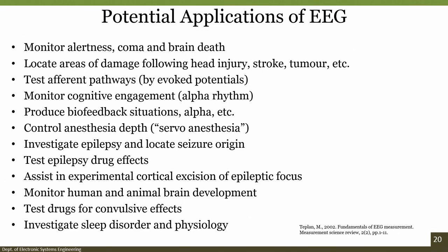It can be used for investigating epilepsy and locating seizures. It can be used to understand the efficacy of drugs, which are anti-epileptic drugs. It can be used in assisting in experimental cortical excision of the epileptic focus. It can be used for monitoring human and animal brain activities and development. It can also be used for testing drugs for convulsive effects and investigating sleep disorders, as well as physiology. So the applications of EEG, as you can see, are enormous.